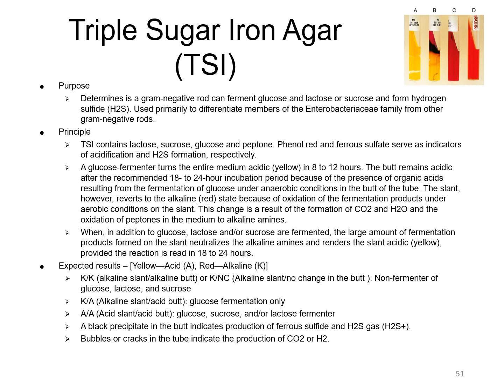So here at the top you have an uninoculated tube in tube D. You can see how the tube would start, so it'd be pretty obvious if that tube color did change. Then from there, if the specimen was alkaline, or if there was no change in the slant or in the butt of the tube, then you have a non-fermenter of glucose, lactose, and sucrose.